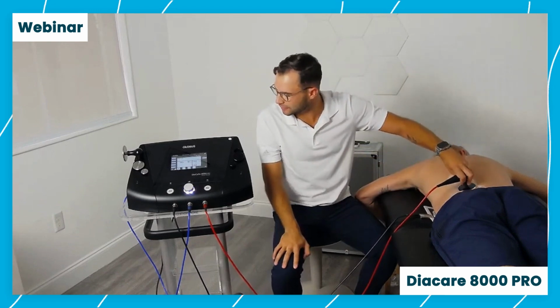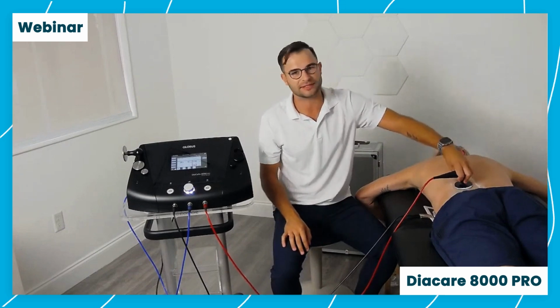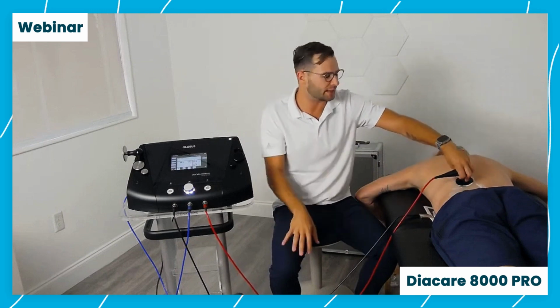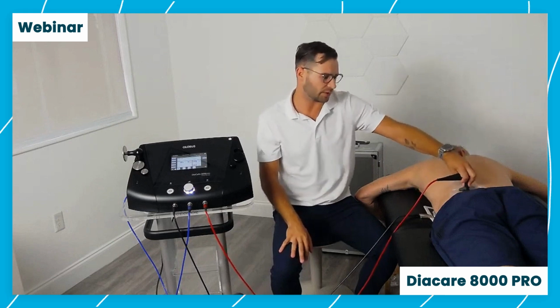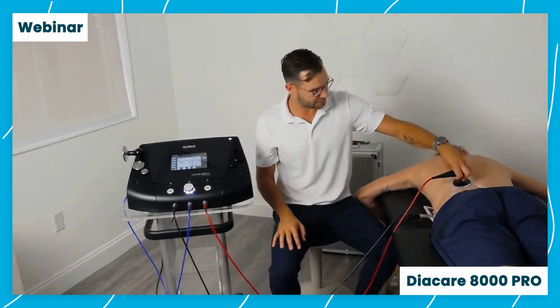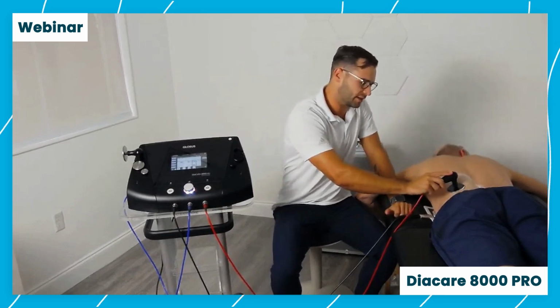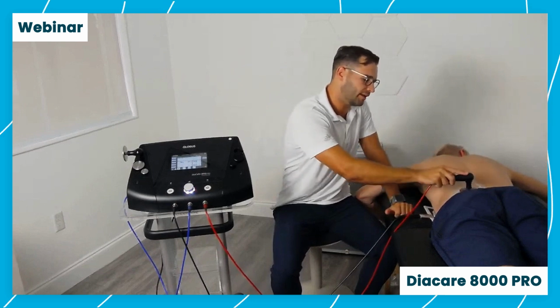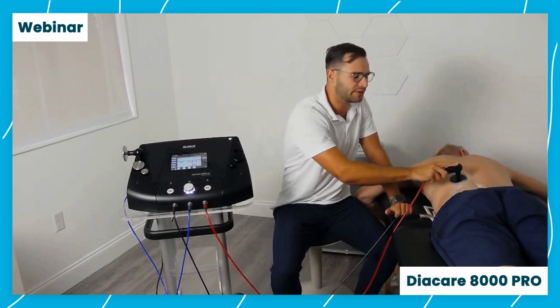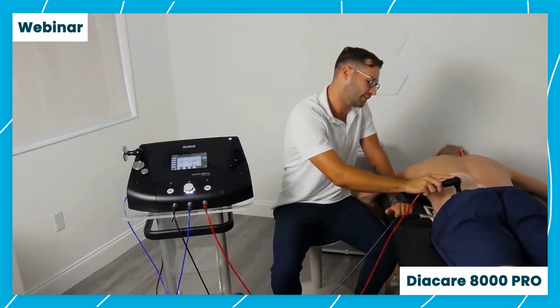You might be hearing a little bit of noise. What you're hearing is if the head of the electrode is getting removed from direct contact to the skin, or you pivot a little bit and it changes on the surface of the skin, you're going to have an audio feedback. So as you can see, if I take it off, you're going to hear that noise. That lets you know that you're not creating great contact, and you can fix the way you're holding the head of the electrode, or figure out if maybe you're not using the correct size head.